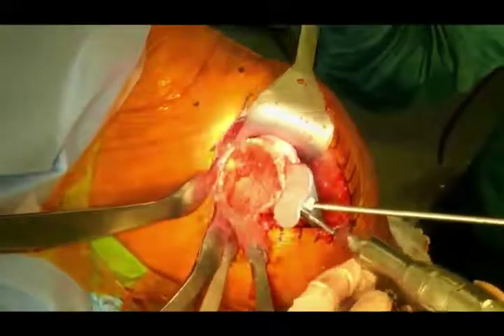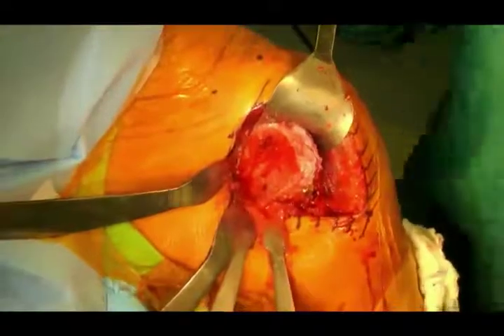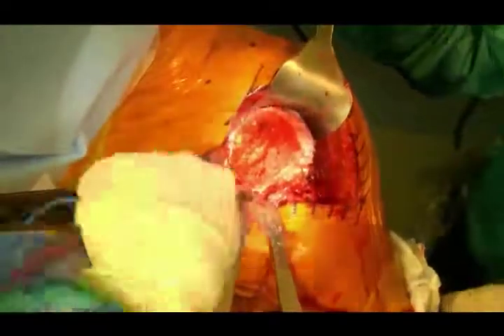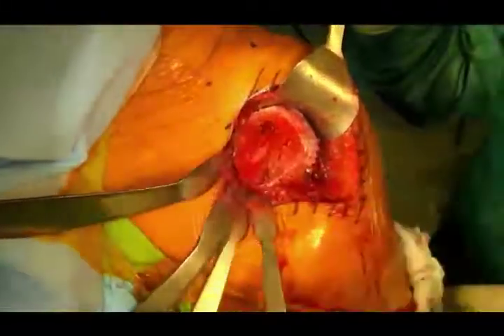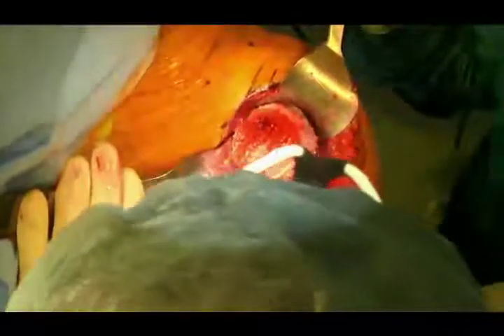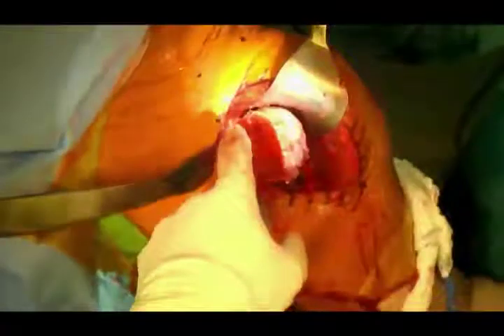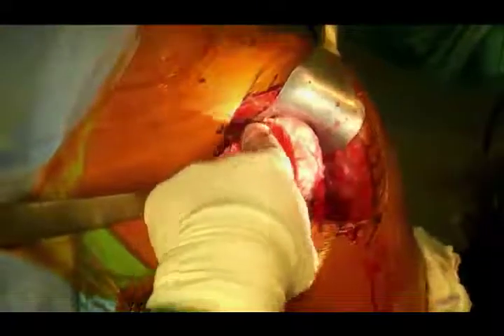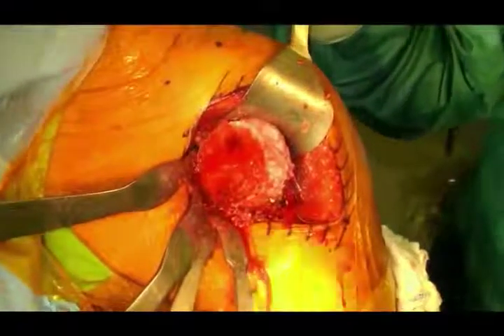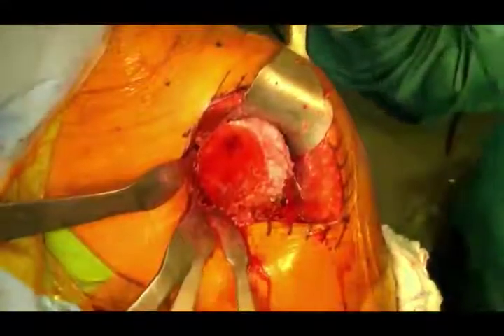I will give the humeral head graft to the tech to make bone graft. His bone looks pretty good — I don't think I'll need extra bone graft. Cleaning up the extra humeral head. The head cut could have been a little larger, but the reamer for the stem will actually ream this out and create a nice capturing of bone graft — more so than the morselized bone from the humeral head.